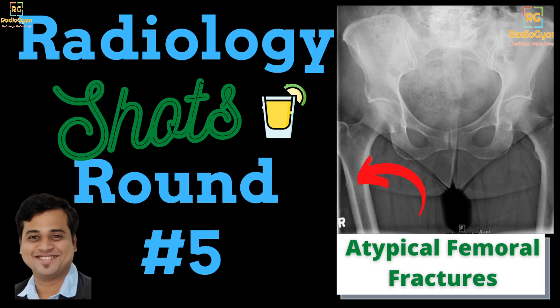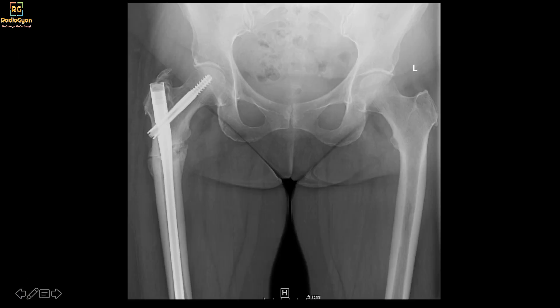Hi, welcome to this short radiology case discussion. This was a patient who presented with a non-healing fracture. This was his initial radiograph. I wanted to look at the old images, so I went back and looked at the prior. This patient had a trivial injury one year back, and after that she had a fracture which was healing.